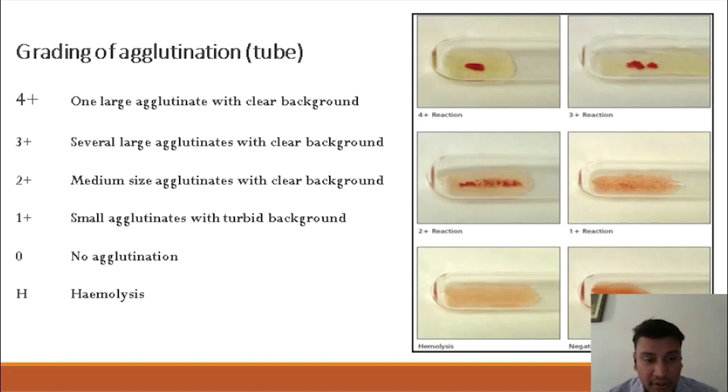0 means no reaction and therefore no agglutination, and H is hemolysis, which is a very positive reaction. If you see hemolysis, it should be considered as a positive reaction and recorded appropriately.